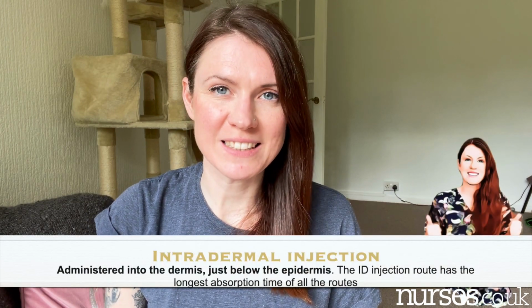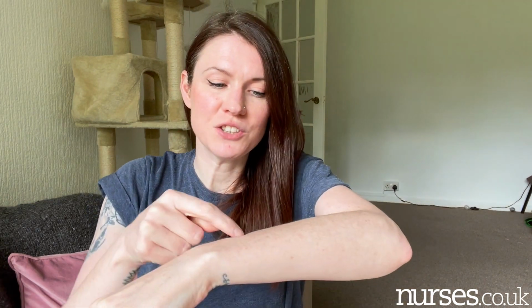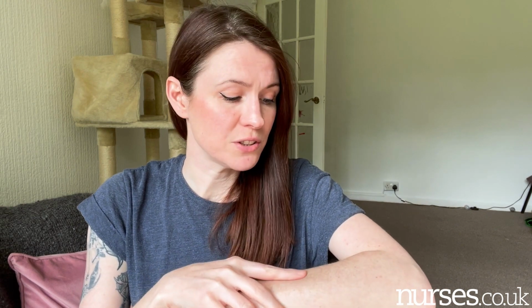So next we have the intradermal injection. This sits just under the epidermis into the dermal section of the skin, so it's literally just below the skin surface. Things like implants. If anyone has ever seen or had a contraceptive implant, that is the type of injection. It literally just slides under the skin and sits under the skin. And this type of injection or implant that sits just under the skin has the longest absorption route.